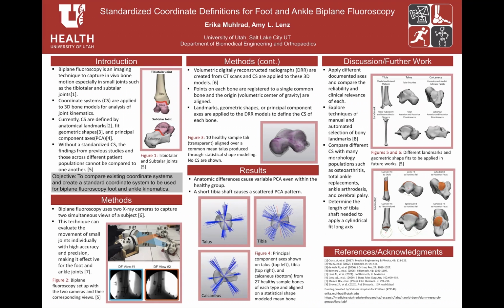This project, Standardized Coordinate Definitions for Foot and Ankle Biplane Fluoroscopy, is an IRB approved protocol and consists of 27 individuals. In the Lenz group at the Orthopedic Research Lab, we use an imaging technique called biplane fluoroscopy, or biplane fluoro. Biplane fluoro uses two X-ray video cameras running simultaneously and capturing two different views of a subject performing a task like standing or walking.